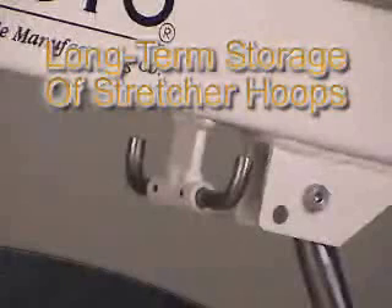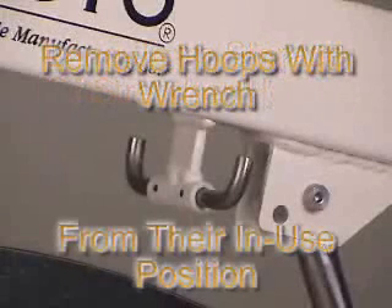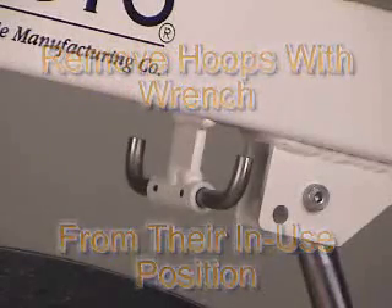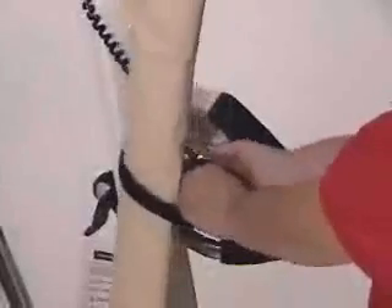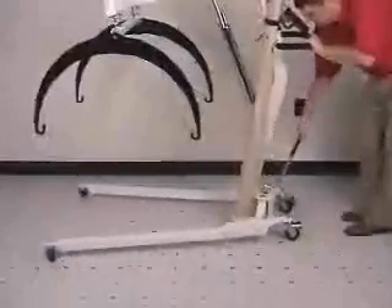This feature is for long-term storage of the stretcher hoops, which may be removed with a wrench from the regular in-use position and placed conveniently on these hooks. To transport the IB600, remember to roll the stretcher up, place it in the cup bracket, secure the Velcro straps, and make sure the scale legs are together securely.